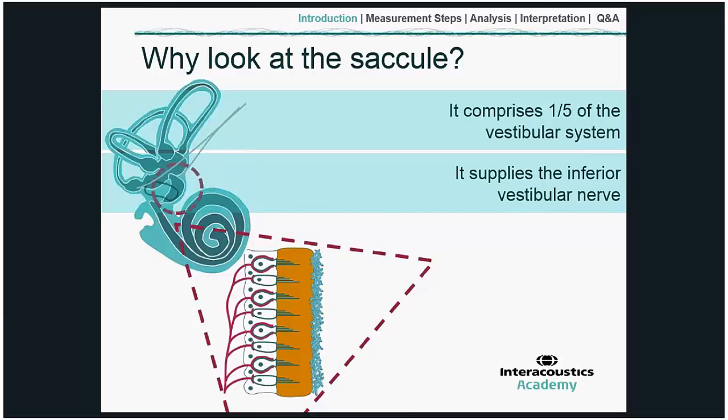And it's important to know that when looking for this particular disorder on the vestibular nerve, we need to be able to really locate the site of lesion: is it on the superior vestibular nerve or is it on the inferior vestibular nerve? And the cVEMP therefore gives us a very nice test to detect that.